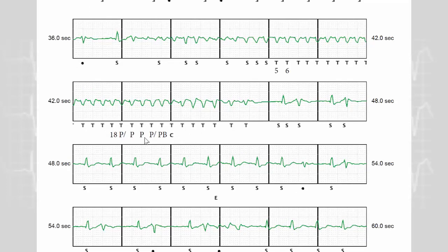The smart charge is a feature that allows for extending time to detection for a patient with prior non-sustained ventricular tachycardia. The smart charge will automatically extend the initial detection time to allow self-termination of non-sustained arrhythmia.